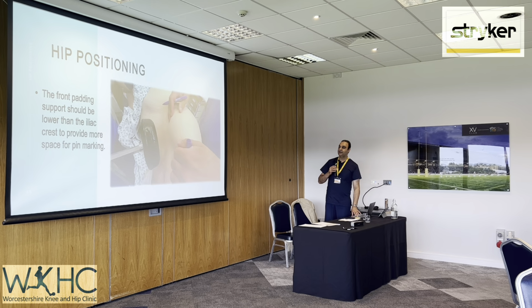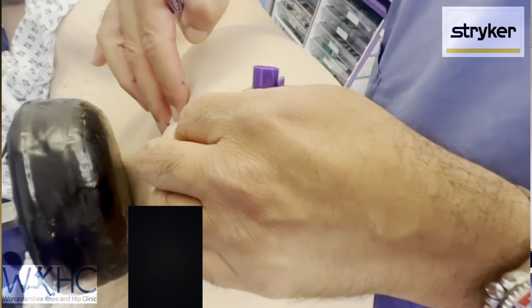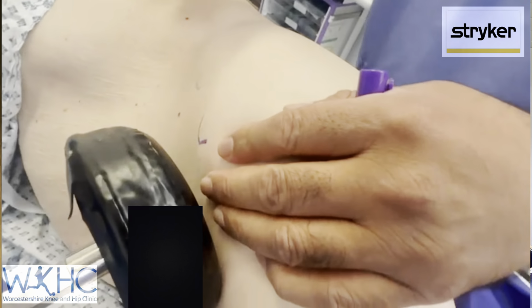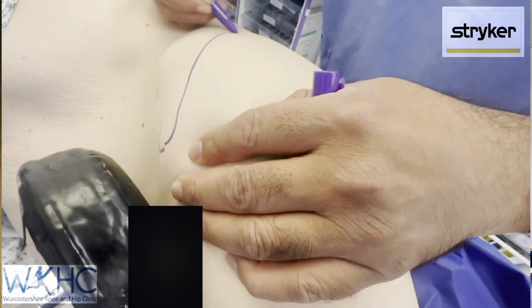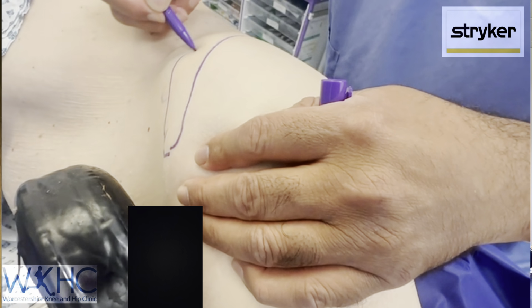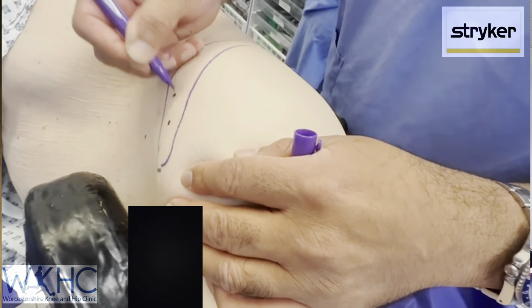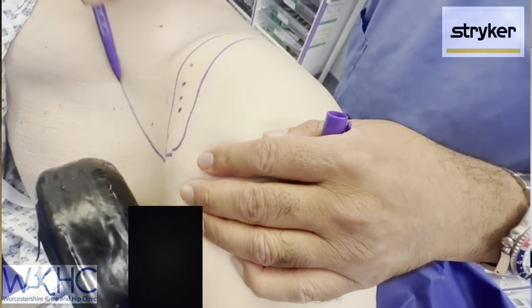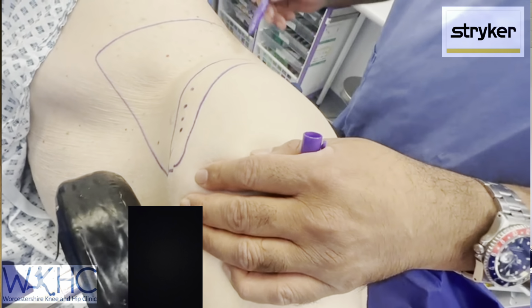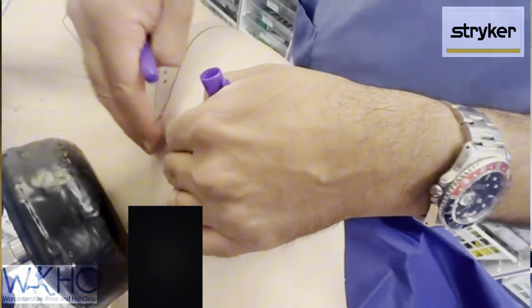Then we found that we have to make sure that the prop at the front of the hip doesn't get into the way of where you're going to put the pins. So we recommend that you mark the iliac crest, which is what we're showing there, and then you feel the bone, and you put 3 or 4 dots where you're going to put the pins. And then you need to make sure that the prop at the front, if you're somebody assisting or positioning, doesn't go higher than the iliac crest.